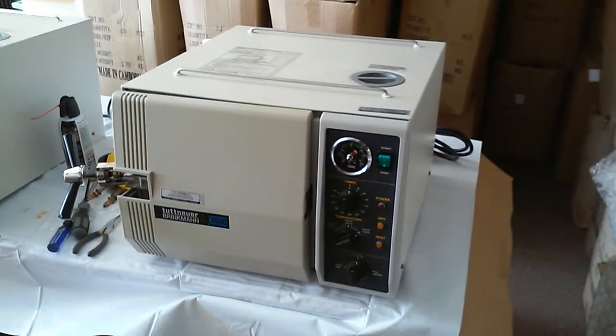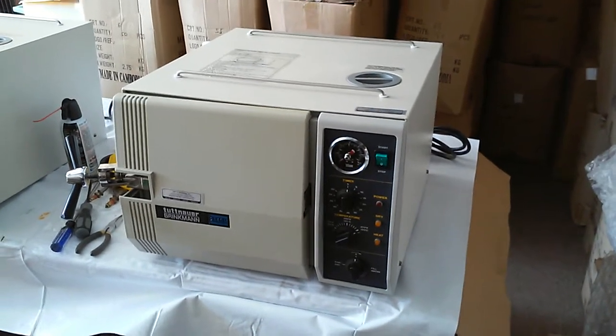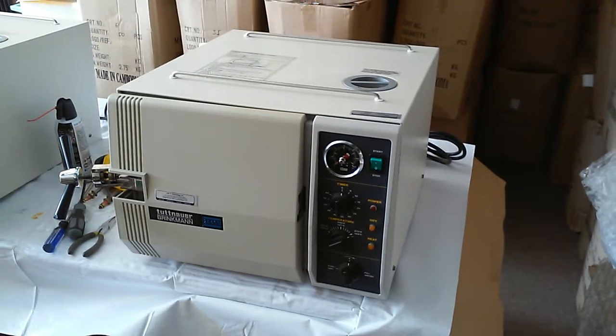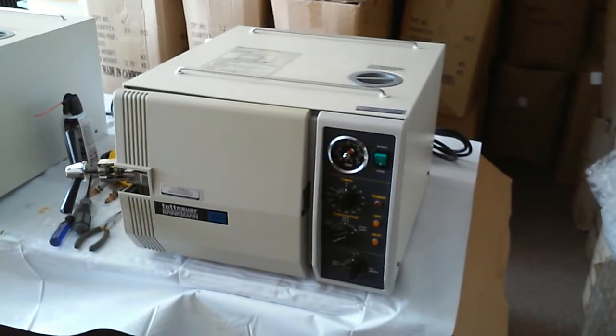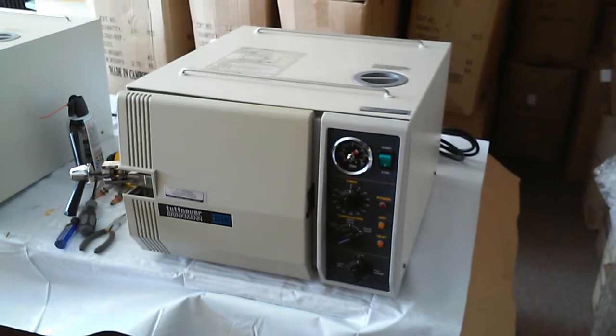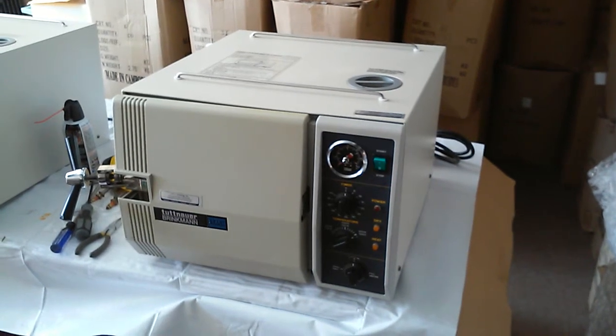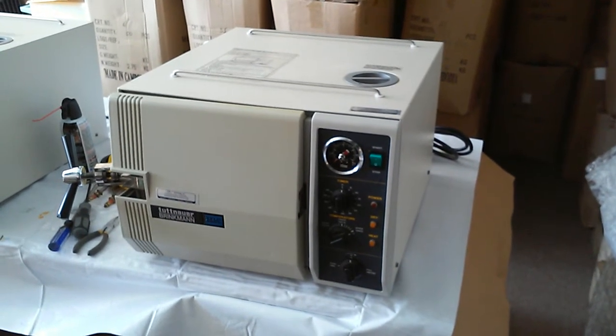For this manual sterilizer, it's very easy to do troubleshooting work. As long as you have an ohm meter, you can probably do all the work. You just check on and off, and you can also check the heating element — the ohm reading for each heating element. Then you can find the problem. It's very easy.